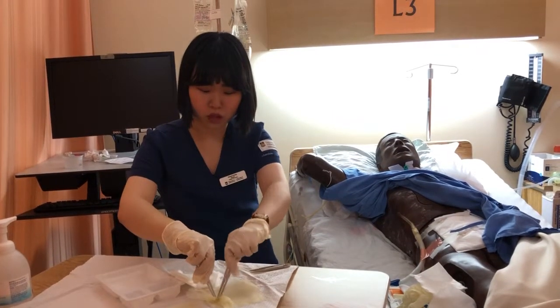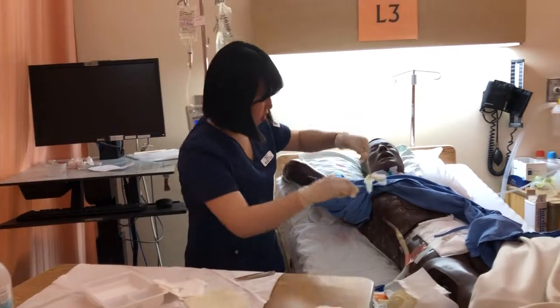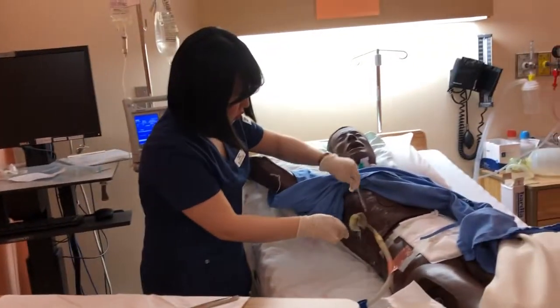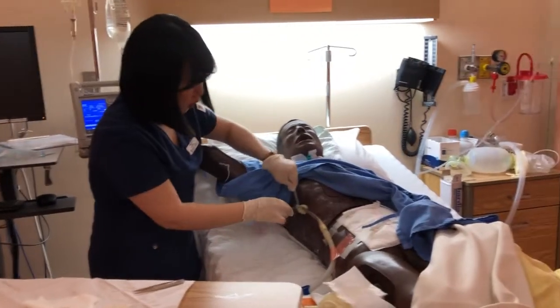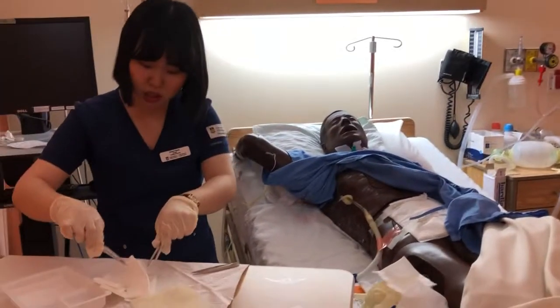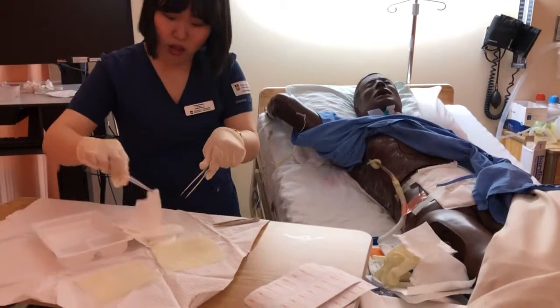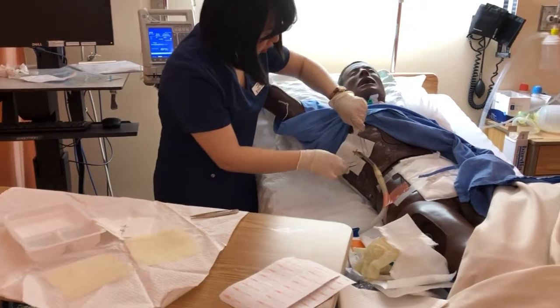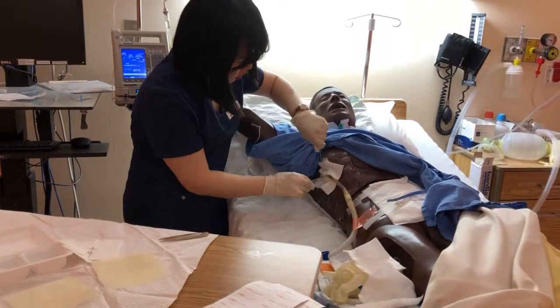I'm gonna grab this, and I'll go to make sure it's fully occlusive, no air leakage coming out from the chest tube side. And then we're gonna put a 4x4 here with this.